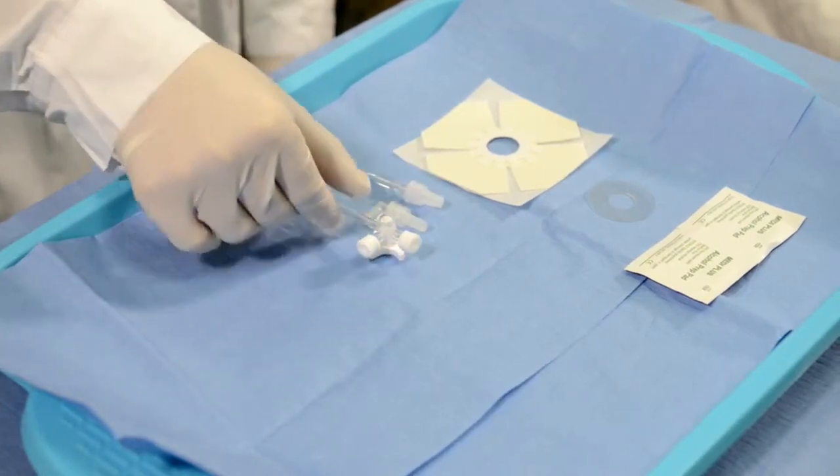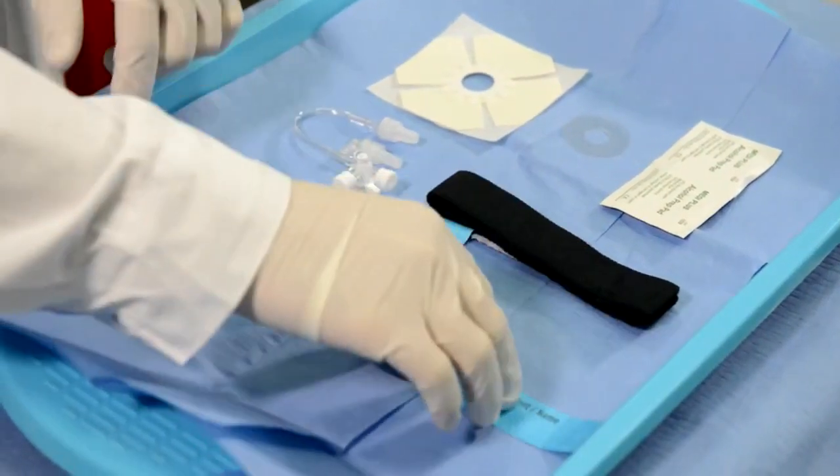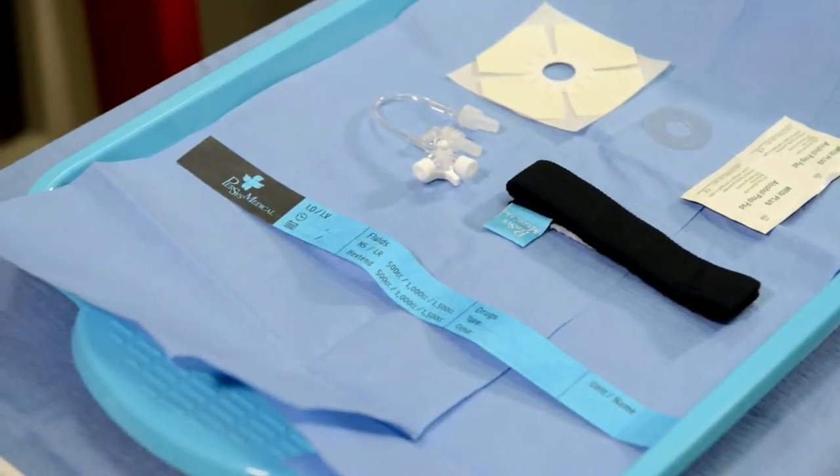Three-way stop-cock extension set. The secure I.V. strap. Patient wristband. The GO-IO kit contains all commonly utilized items for an I.O. procedure.